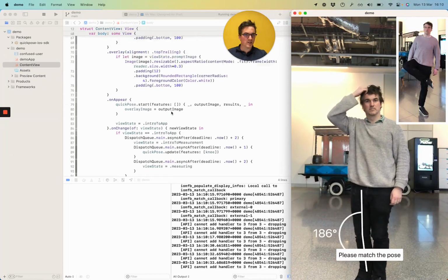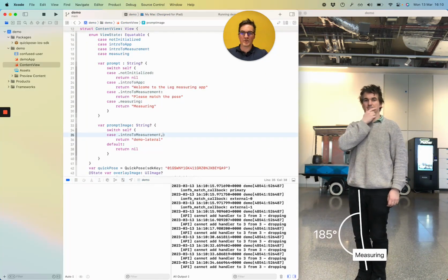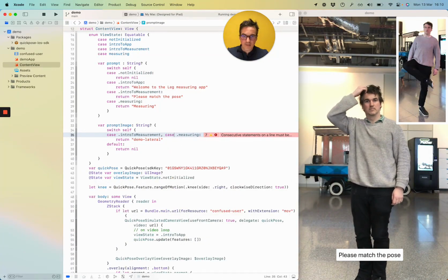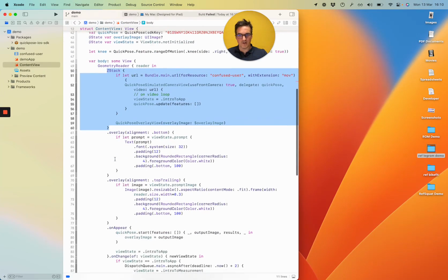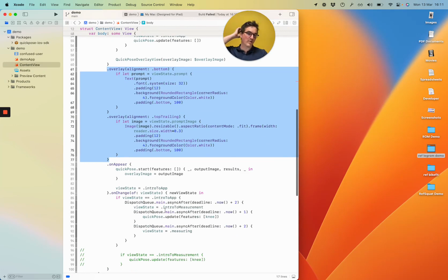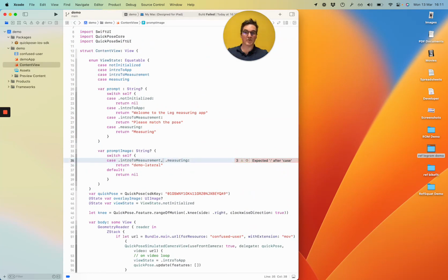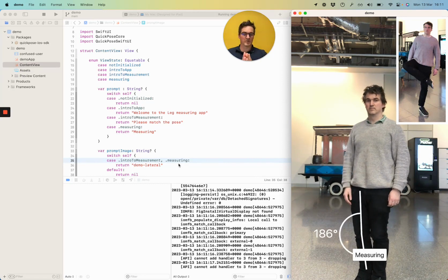I did want to keep the image during the measuring stage. So up here now in the view state, we can change that. So case measuring. Just as a bit of a recap on what we're doing here, we've got our view components down here. We've got our overlays, and then we've got some logic here changing the QuickPose features and updating the state. But the state and the logic behind it is all up here in our enum. And this is called a state machine, where you just progress through different states, but the logic is kept very still and well managed.